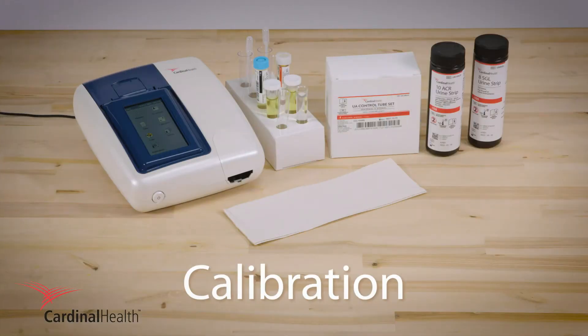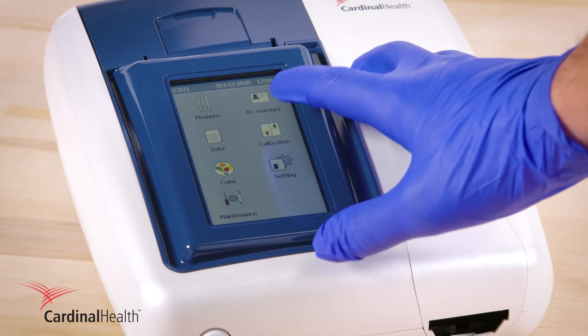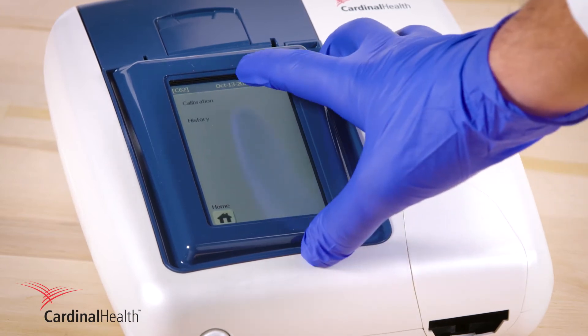Calibration is required whenever the product lot number changes. Locate the lot number on the urine strip product packaging. Under calibration, enter the 5-digit lot number.